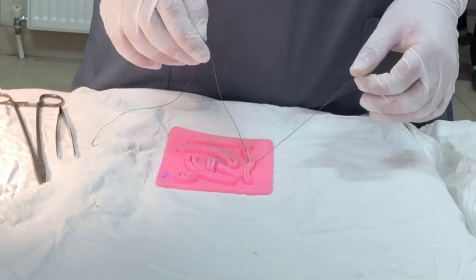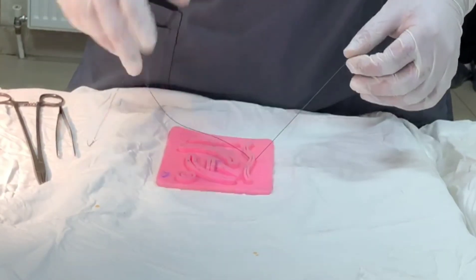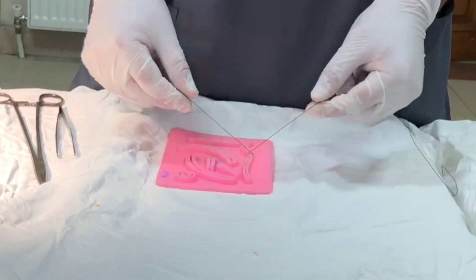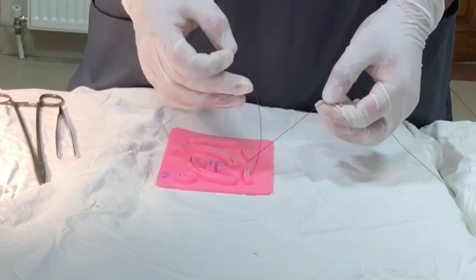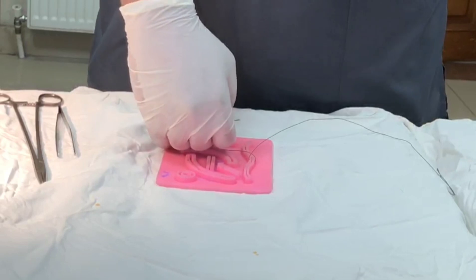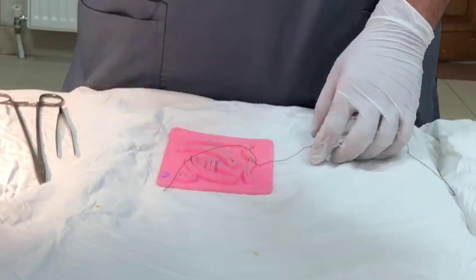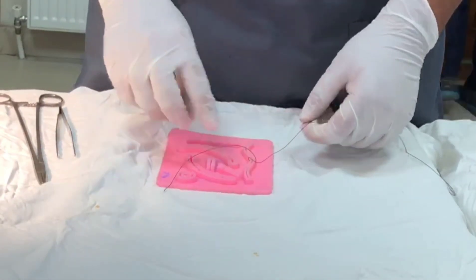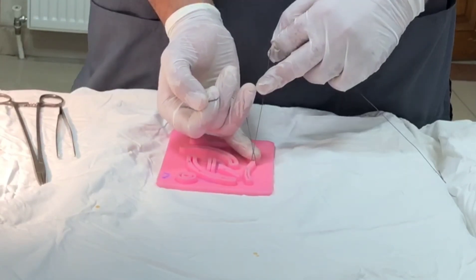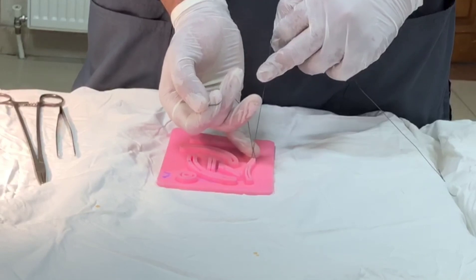I'm just going to cross the right and the left hand. Now see — the short end is towards me and the long end is away from me. I'm going to tie a reef knot with only the right hand. This is very important for securing the knot.